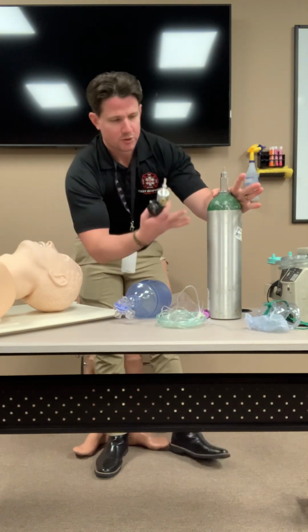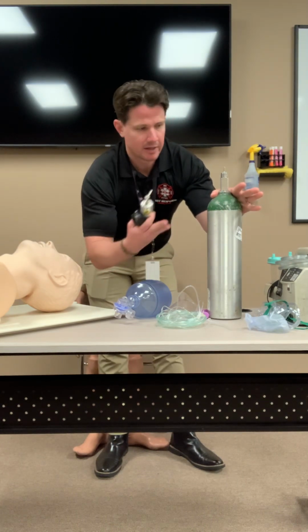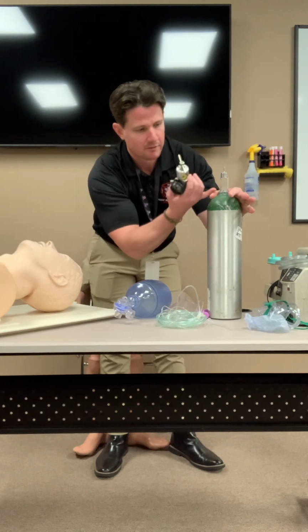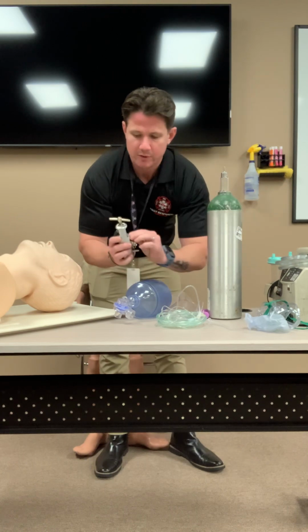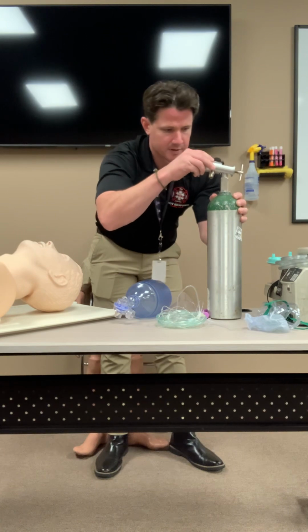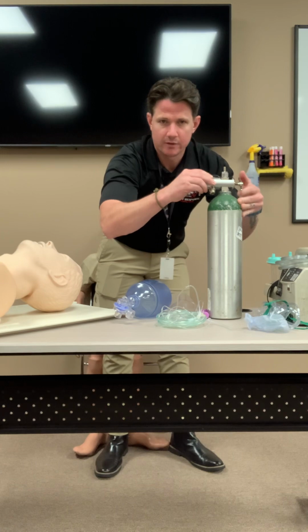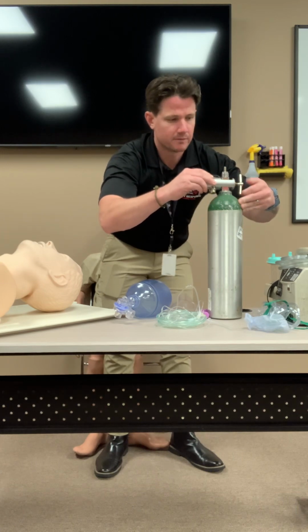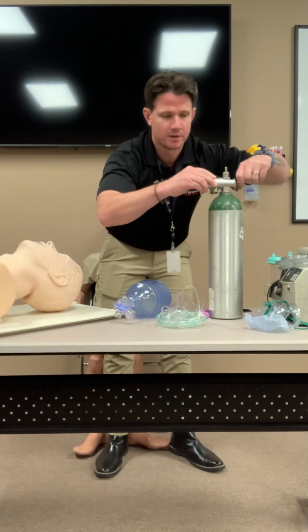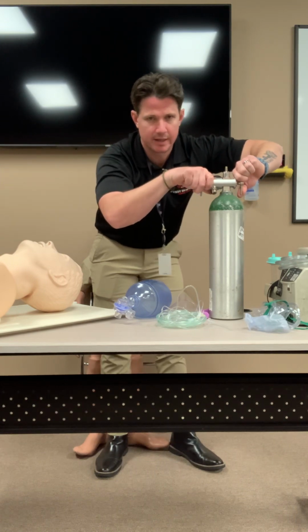Now, next thing we're going to do is connect this to our oxygen tank. When you're doing this, I know there will be nerves. Take a quick second, take a deep breath, slow down, and look at what you're doing before you apply this. Make sure you apply this the right way. Find the side that has the 2 holes, find where the 2 prongs are, and match the prongs to the holes. We're going to slide this over, just run it down until you feel the regulator sit into those holes. Then you're going to tighten down the regulator on this side, rotating this screw, just hand tight. You don't have to wrench it down, just nice and hand tight.